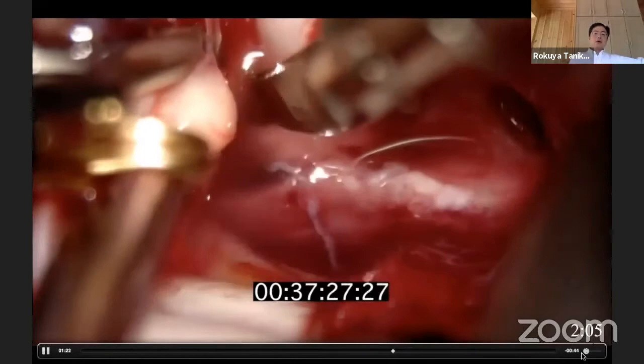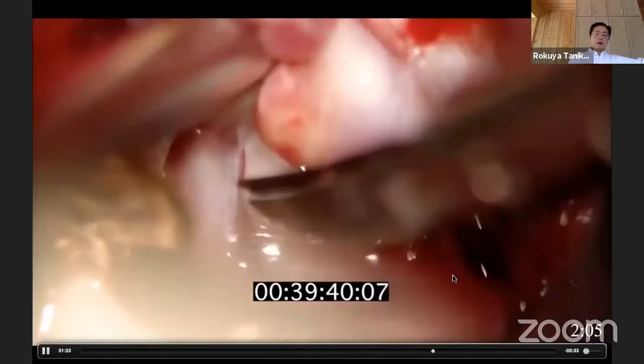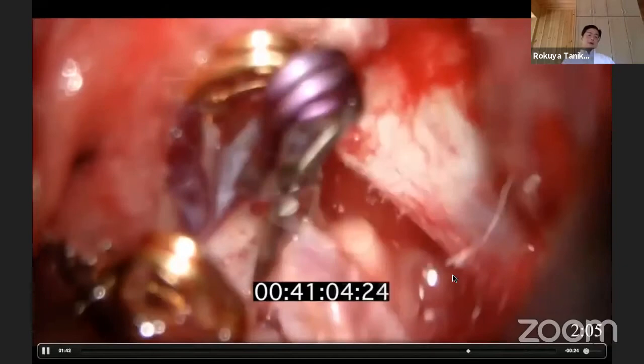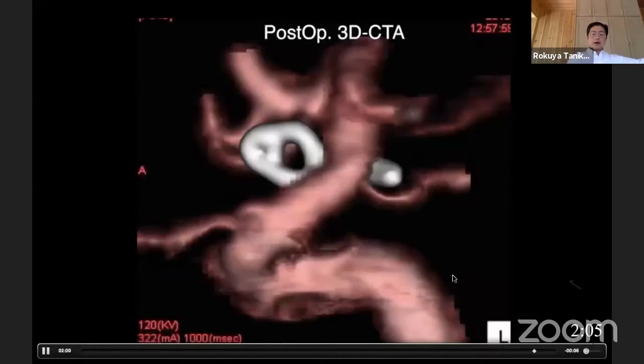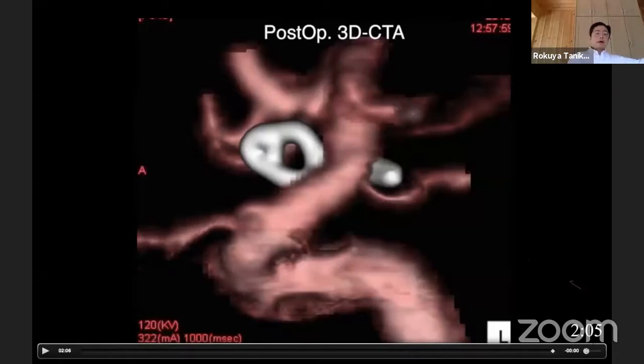This is the oculomotor nerve adherent to the aneurysm. Here posterior to the oculomotor nerve is the injured part of the temporal uncus from the aneurysm rupture. Now the aneurysm is completely detached from the oculomotor nerve and the normal anatomy is confirmed. The PCOM and the anterior thalamoperforating arteries are preserved — ICG shows good patency. Postoperative CT scan and 3D CT angio confirm complete neck clipping with no neck remnant, especially at the medial part.